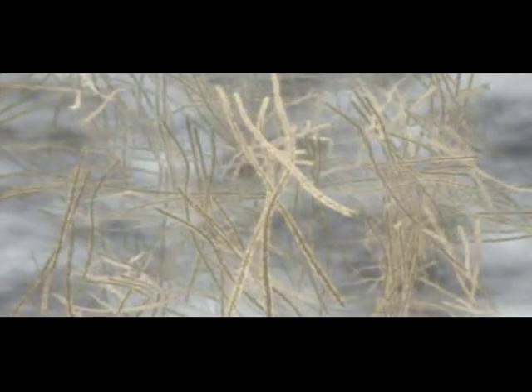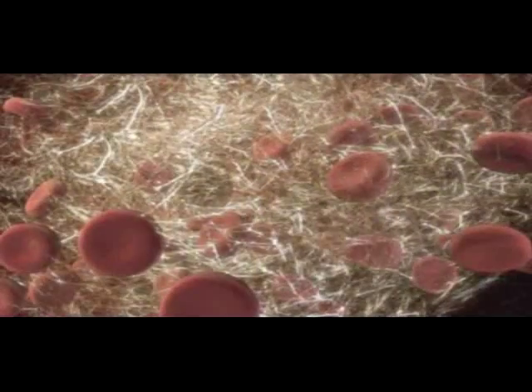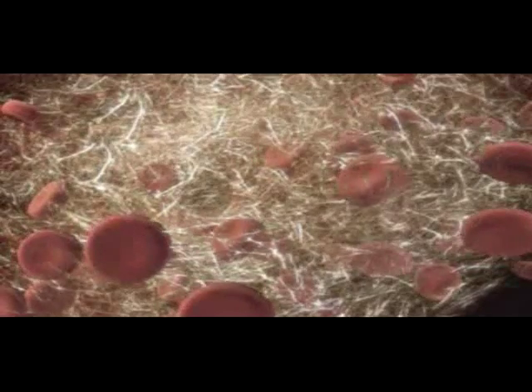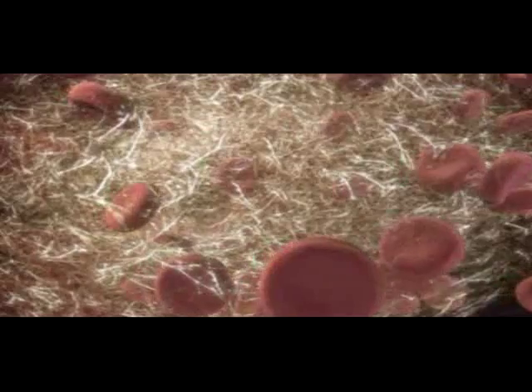Activated plasminogen is converted to plasmin which dissolves the fibrin strands. As fibrin strands dissolve, red blood cells and other blood components trapped in the fibrin matrix are released into the blood.